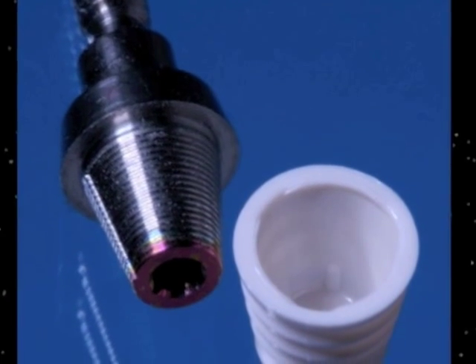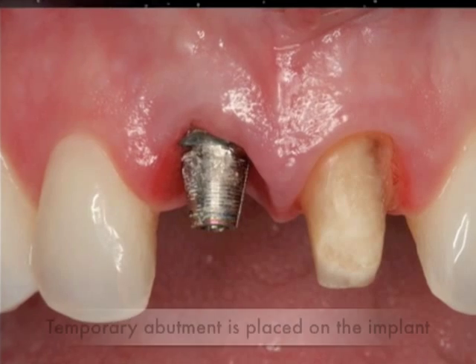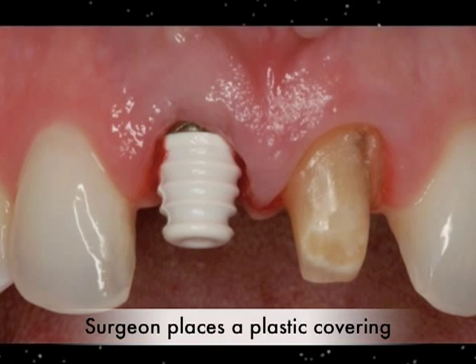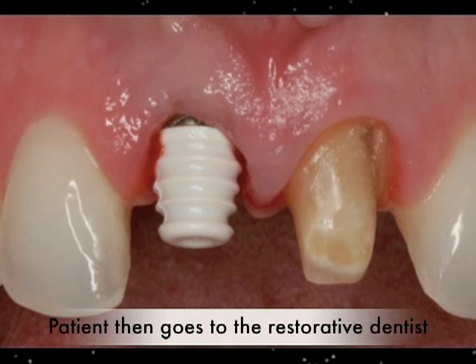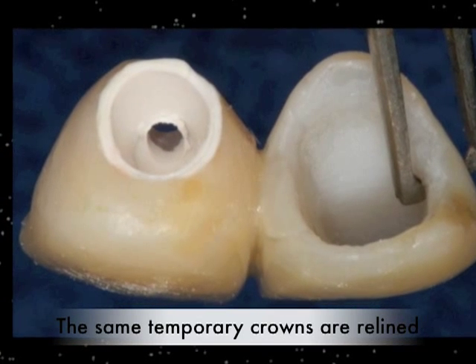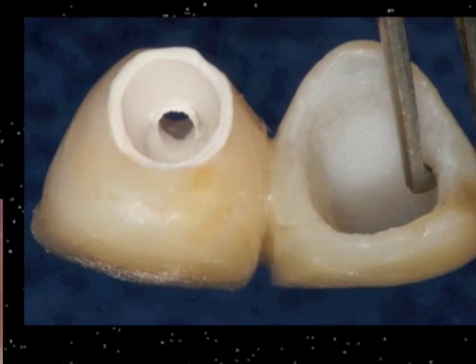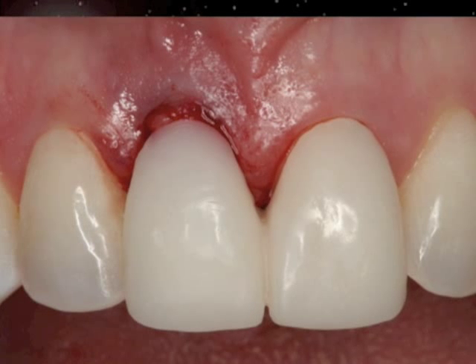and us to be able to place an immediate temporary abutment. This temporary abutment is simply screwed on the implant and, again, houses a plastic coping that then the surgeon can transfer the patient to the restorative dentist, and the restorative dentist simply can reline that previous provisional to fit on the implant and plastic cap. And so this patient has an immediate restored implant the day of implant placement.